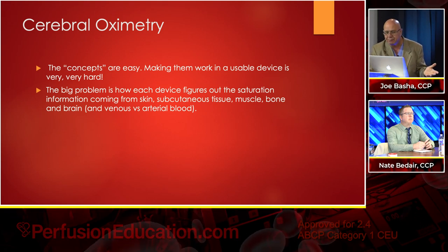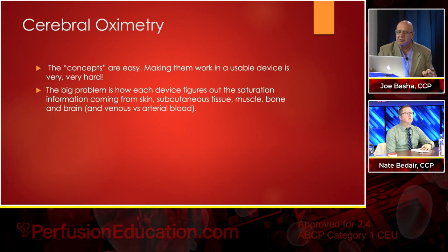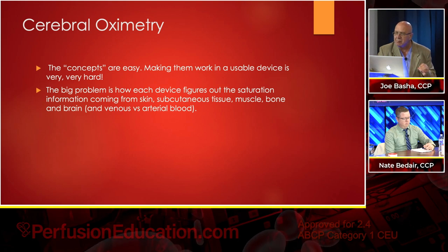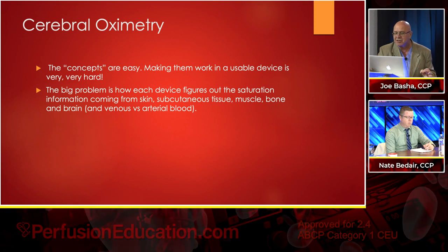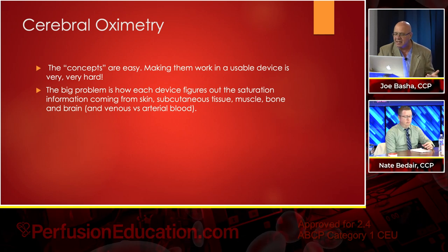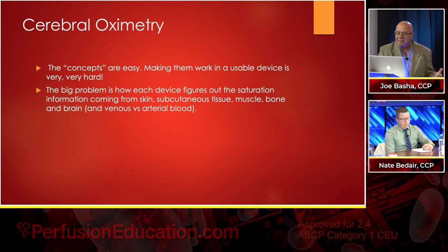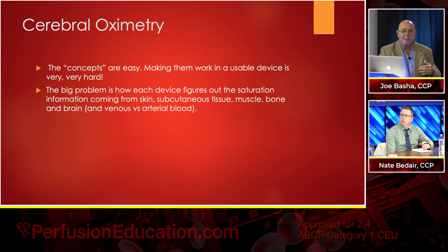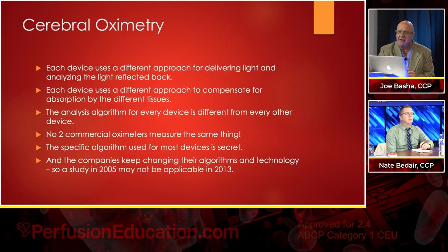Cerebral oximetry. The concepts are easy to understand. Making them work in a usable device, however, is not so easy. The big problem with cerebral oximetry devices is that they figure out the saturation from putting a sticker on the forehead that has to go through the skin, the subcutaneous tissue, the muscle, the bone, and then ultimately to the brain and venous versus arterial blood, because you're going to have a mixture. It's not going to be arterial or venous, it's going to be both. So there's a lot of confounding factors.